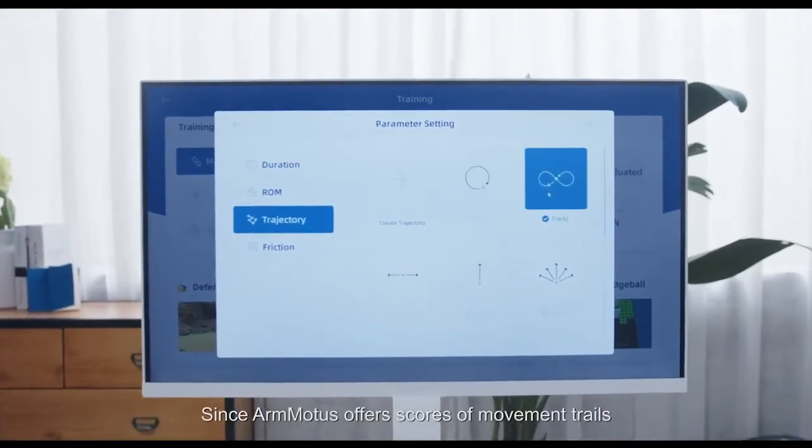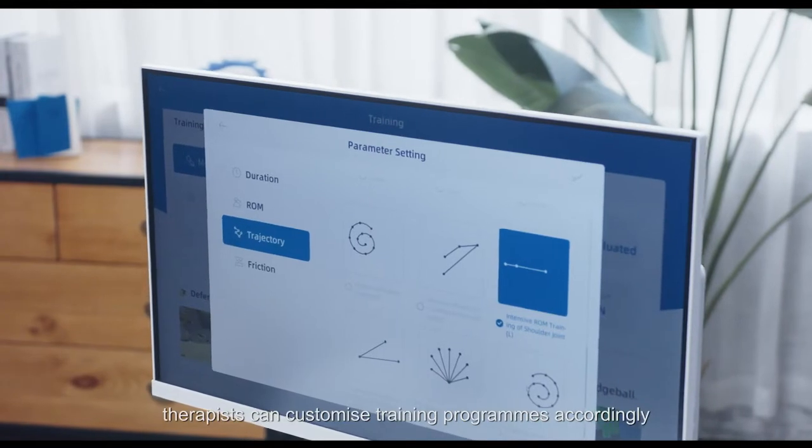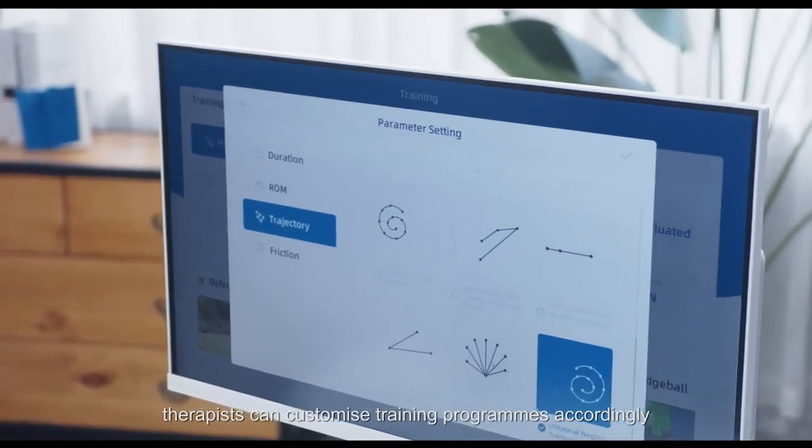Since ArmModus offers scores of movement trials, therapists can customize training programs accordingly.